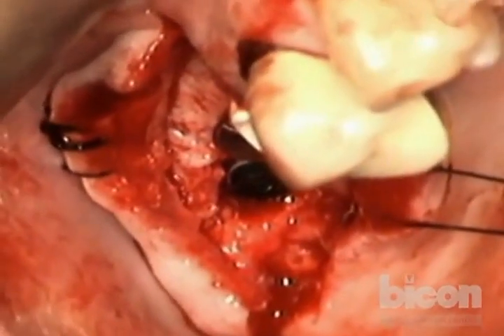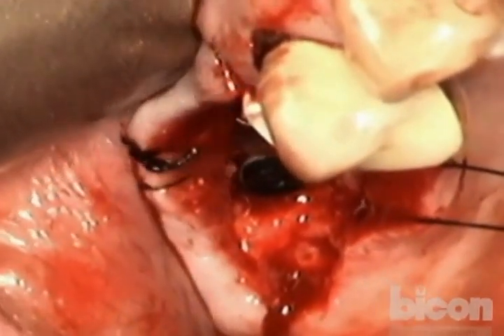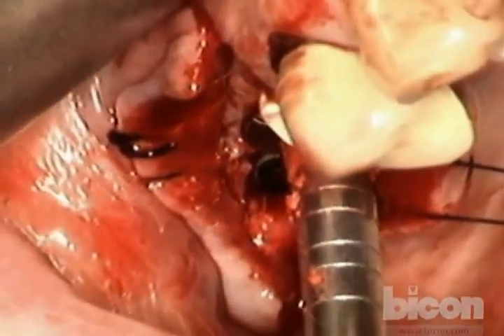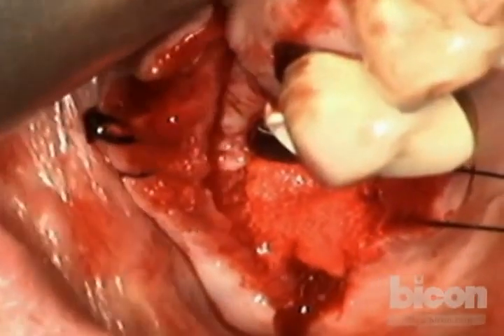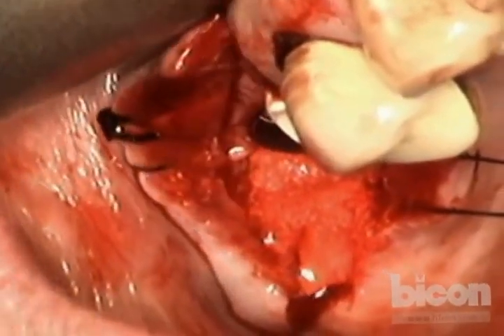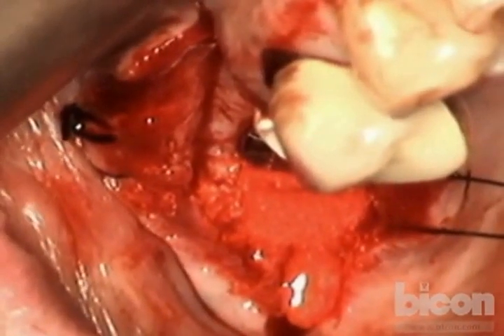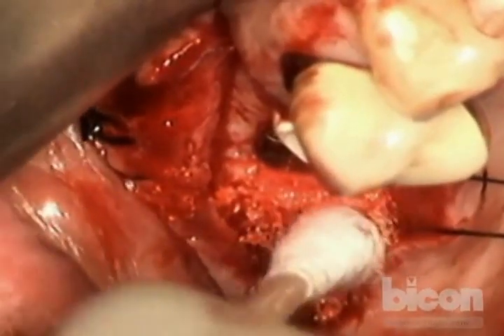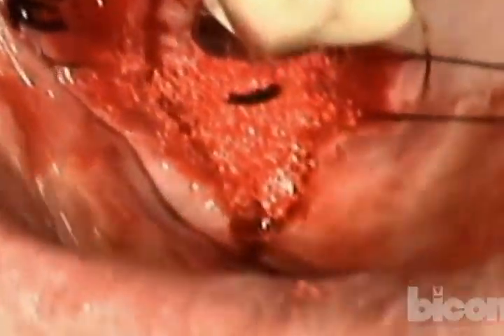And finally, we'll just backfill the osteotomy. And no more hammering. I'm sure you're happy to hear that. Okay. I'll take a Q-tip. Okay. Good. And we pack it all in. And I'll take the scissors now, Kim. And if you would open the gut suture. Okay, good. All right, open that gut suture.